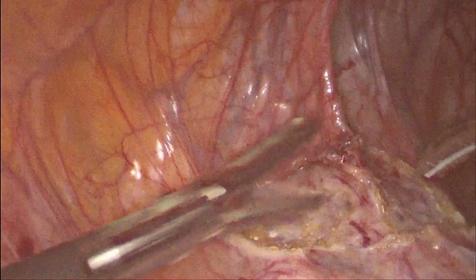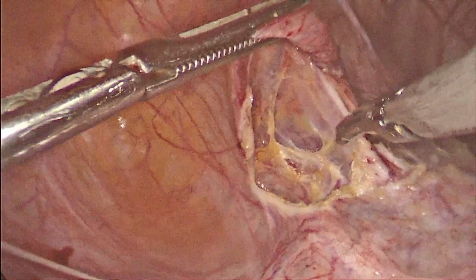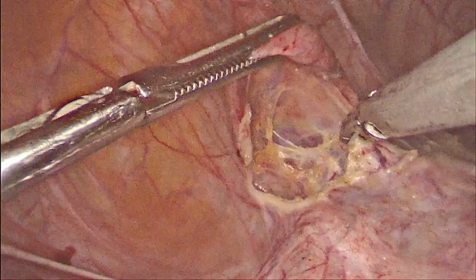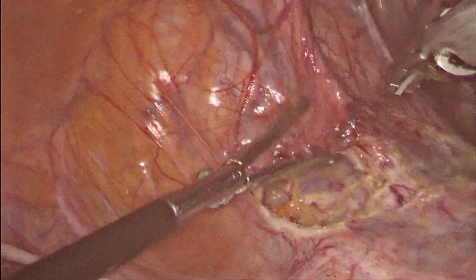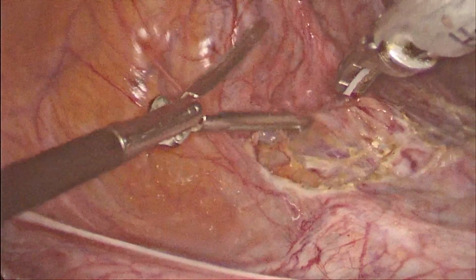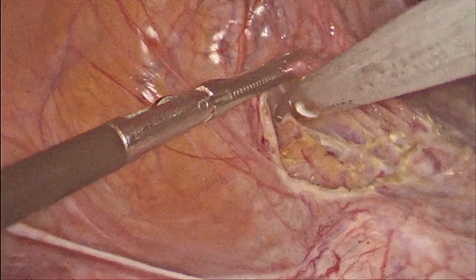So for this, we are using the harmonic scalpel, which has less lateral spread, and we are identifying the fibrous tissue fiber by fiber, and then doing the dissection to keep the bladder well away from the cervix.